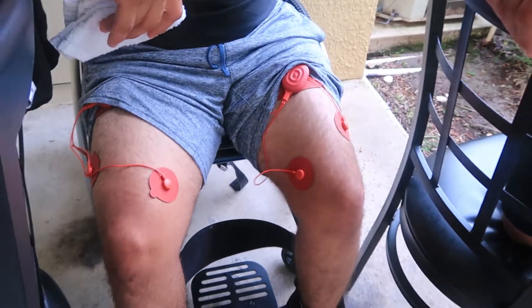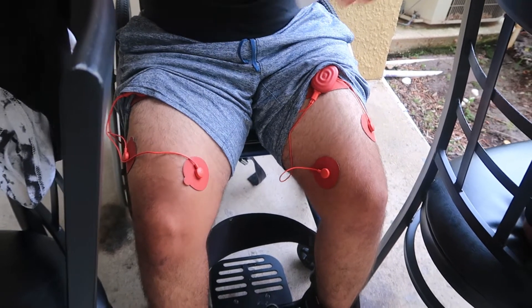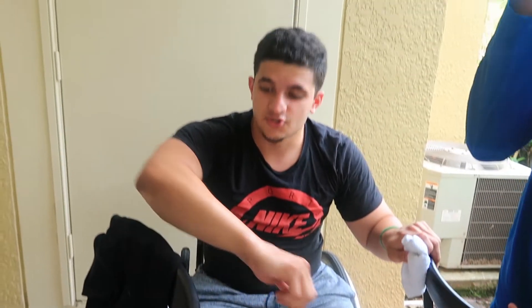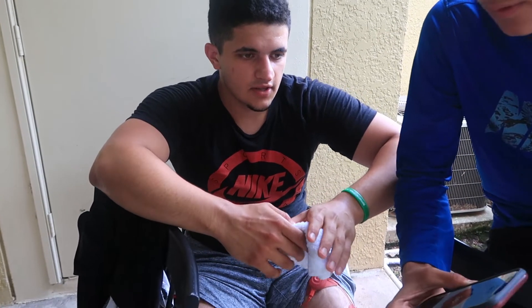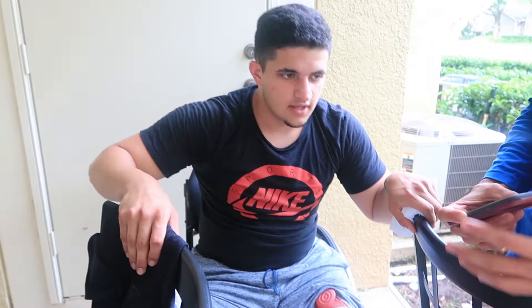Alright, we're going to try it with this setting right here — where it's just continually stimulating the muscles. It's just continuous stimulation. I am sweating, look at that. We're going to see if this does a little something different. I can't put too much electrical stimulation in my legs, especially at a high setting, because from what I've read it can kind of burn out the nerves. So it's good to keep it to a limit, but I think we're good for now. Let's go ahead and finish this one and see if this does anything different for the standing. It's all trial and error.